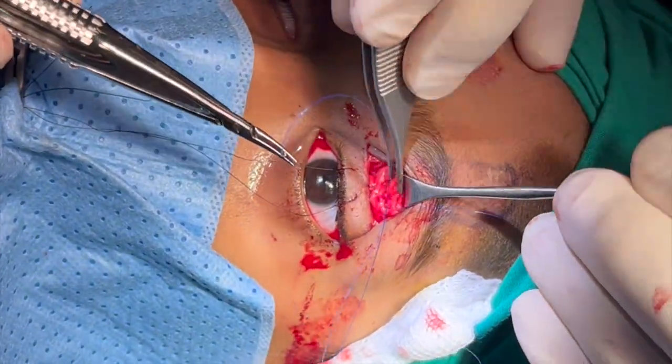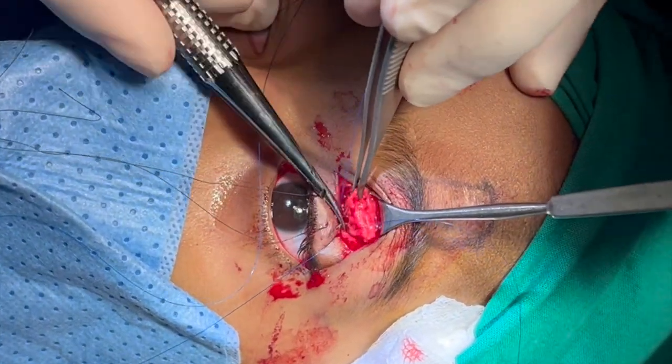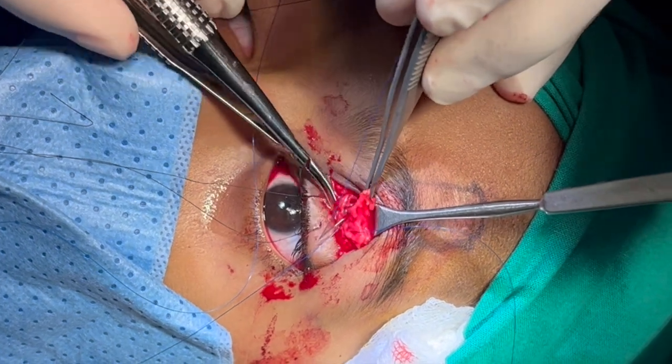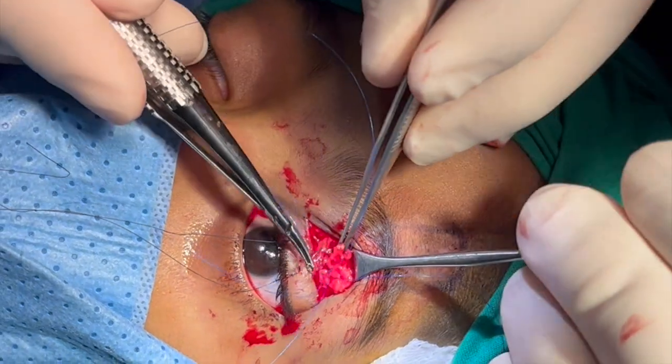The same suture is then passed from the tarsus to the levator muscle and then to the lateral aspect of the frontalis flap. The suture is being passed through the lateral aspect of the flap.